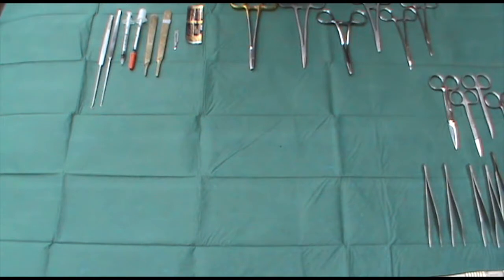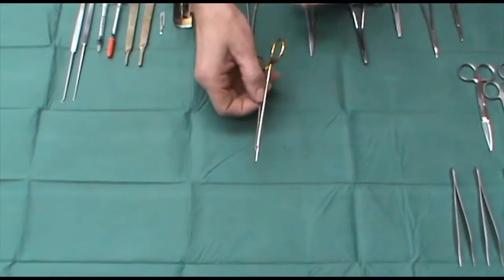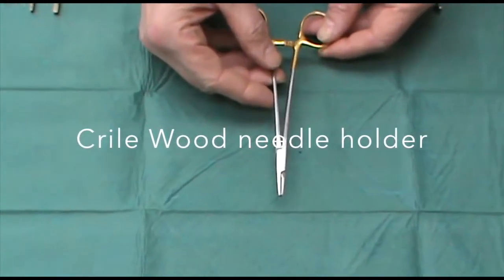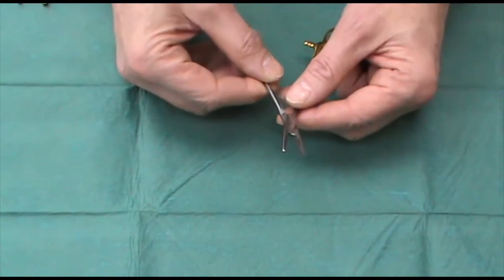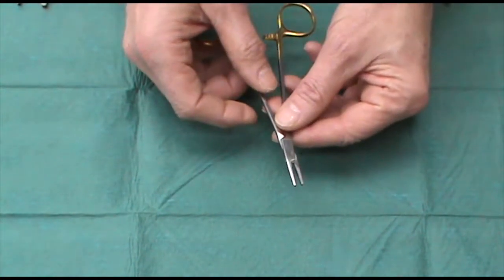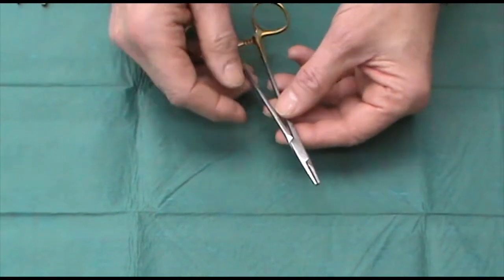First of all, dealing with needle holders — there's a huge range in price and quality. My favourite would be these: a pair of 6-inch Crile-Wood suture holders. The beauty of these is that they have tungsten carbide inserts, which enable them to hold the needle very delicately, but also to hold suture material without damaging it.